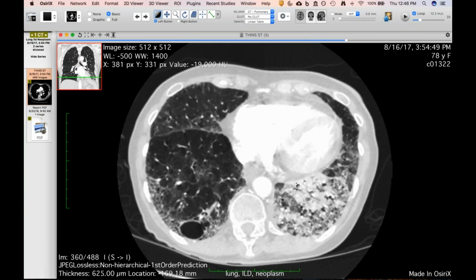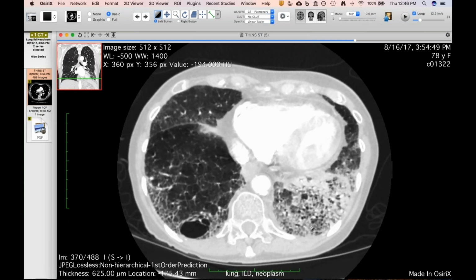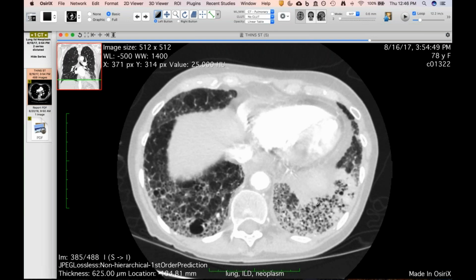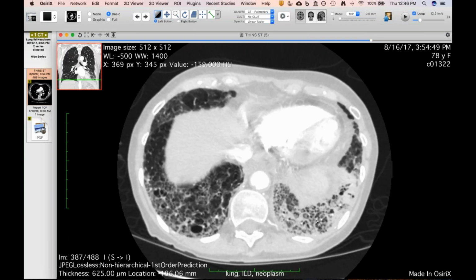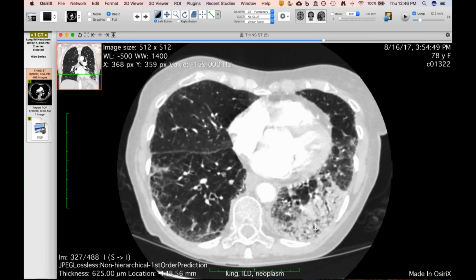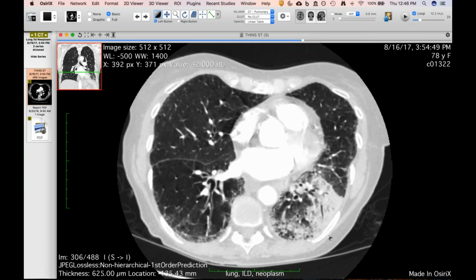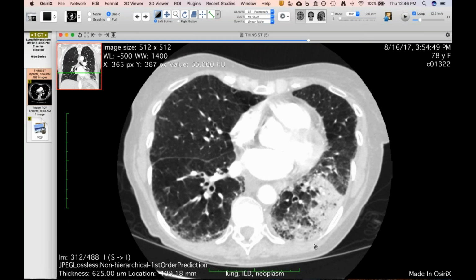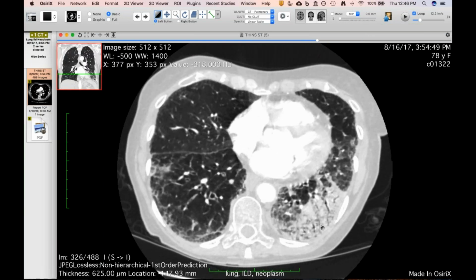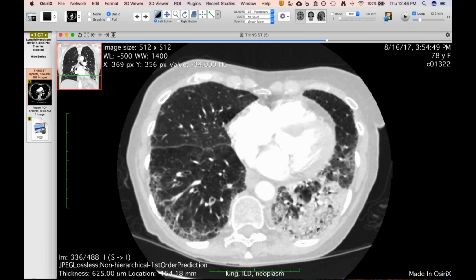Then we were reviewing this in our multidisciplinary conference, and I said that I was very worried about the appearance of her left lower lobe, just because she has all of this asymmetric consolidation and ground glass opacity here. And the pathologist had the transbronchial slides and looked at it and was able to find one cluster of atypical cells, because we were worried about adenocarcinoma.